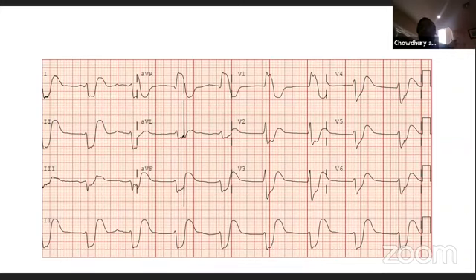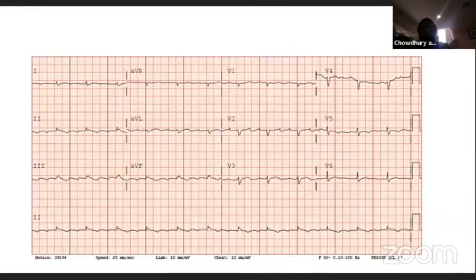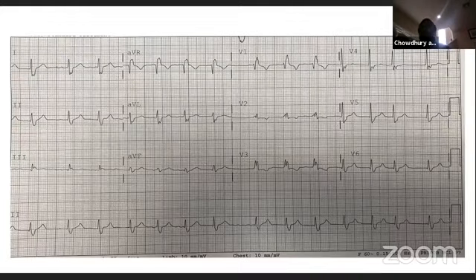The shark has a fin on the top. That is the proper shark fin. Underneath the shark, there is another fin called the pectoral fin that looks like this. So I'm calling it pectoral fin. Pectoral fin is more likely of non-coronary related issues like hyperkalemia. And this is the reason why pectoral fin happens. If you look at the typical right bundle appearance, look at V5, V6, the repolarization phase of the right bundle branch block appearance becomes like the pectoral fin.